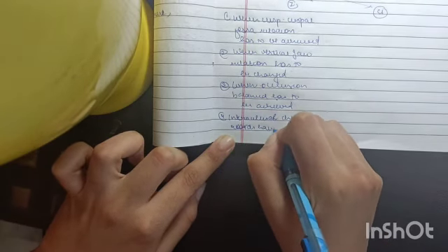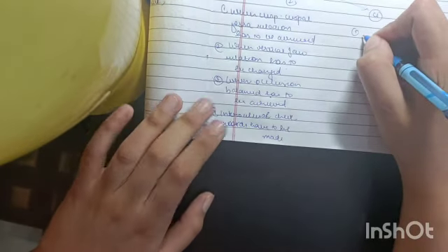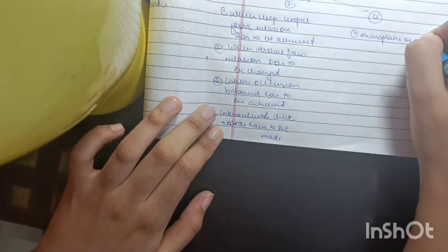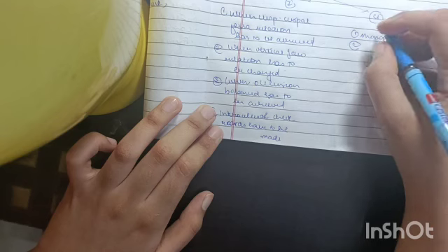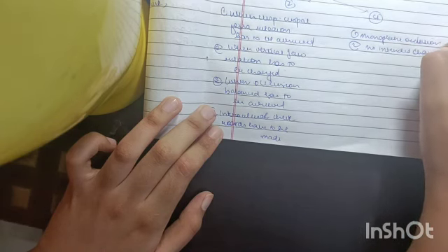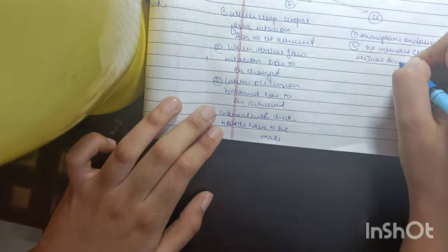Now, in contraindications, when we have to create monoplane occlusion, we will not use face bow transfer. Second is when there is no intended change in the vertical dimension of occlusion.